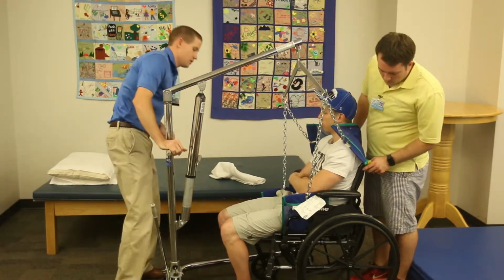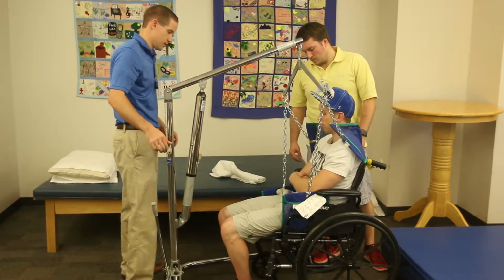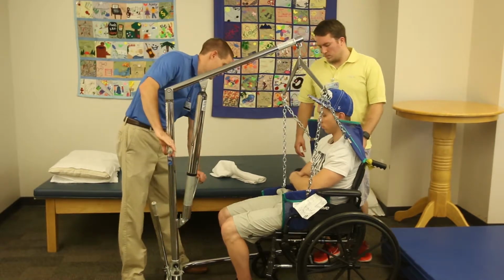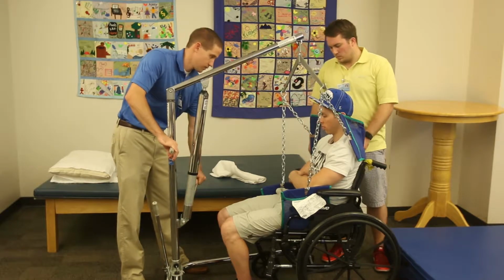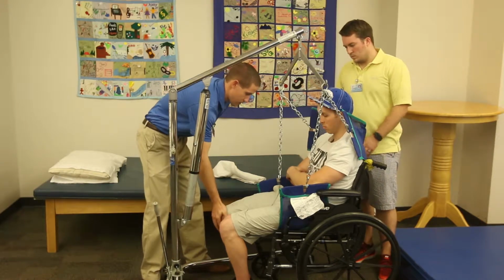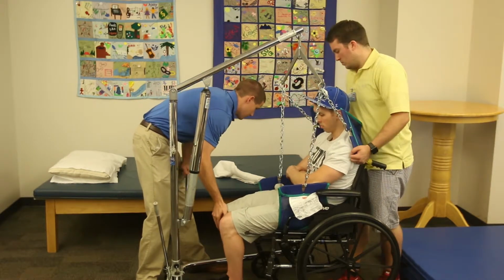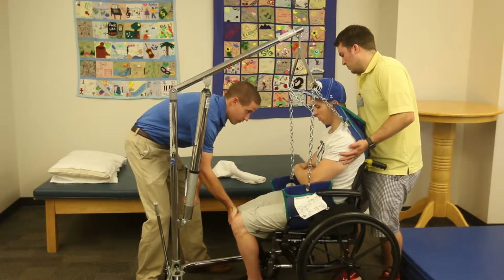Okay. So it looks like he's still forward just a little bit. So what we're gonna do is I'm going to bring you back up just a little bit, and I'm just gonna tuck you back into that chair. Okay, so go ahead and stabilize the back there for me. We're gonna just pull him back there. Yep, there we go.